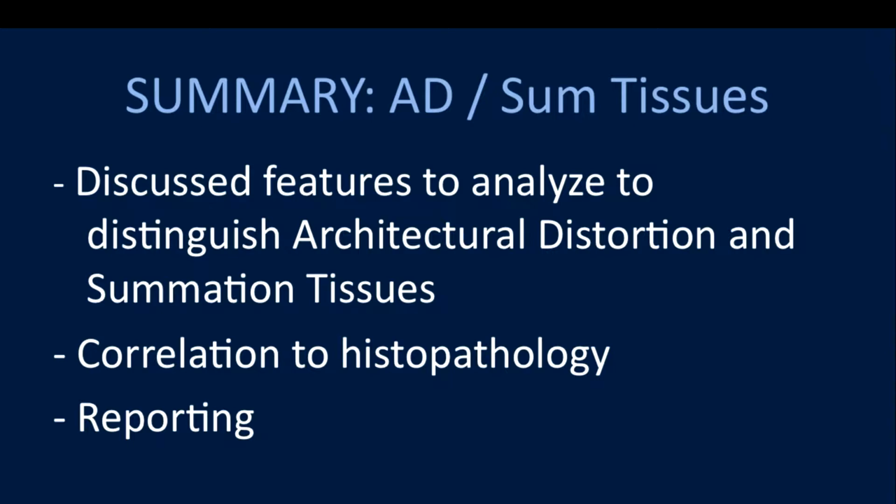What do you think about sometimes if someone calls back for a possible architectural distortion, and then after diagnostic workup you rename it focal asymmetry if you think it has these characteristics? I mean, sometimes there is a focal density there in two views. I don't think that really applies. I guess that confuses me. Do a 6-month follow-up. So to me that's it.